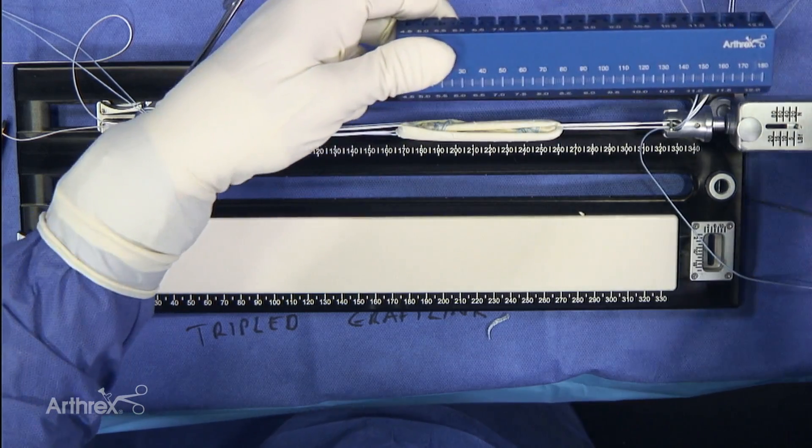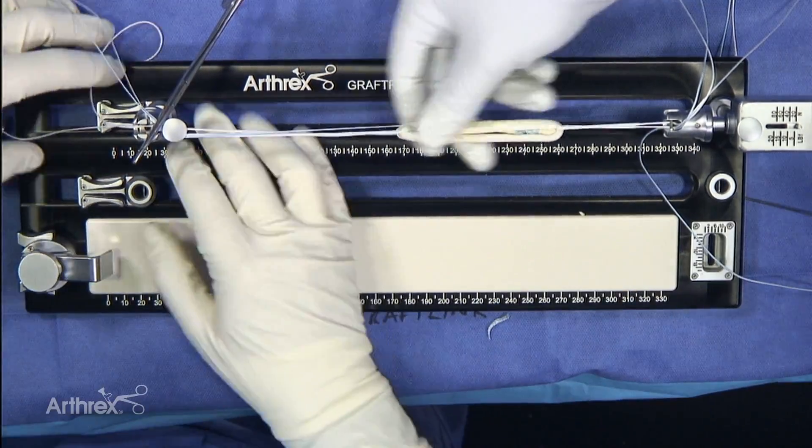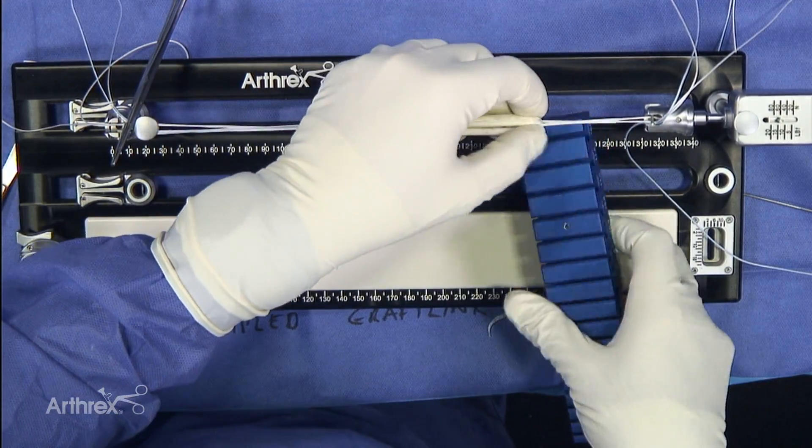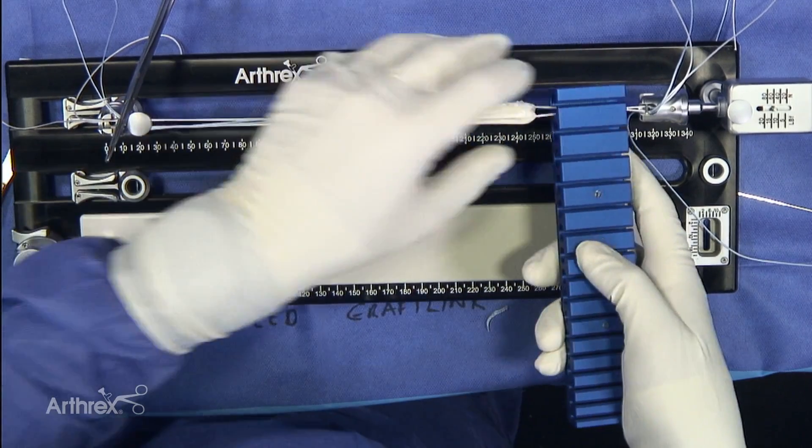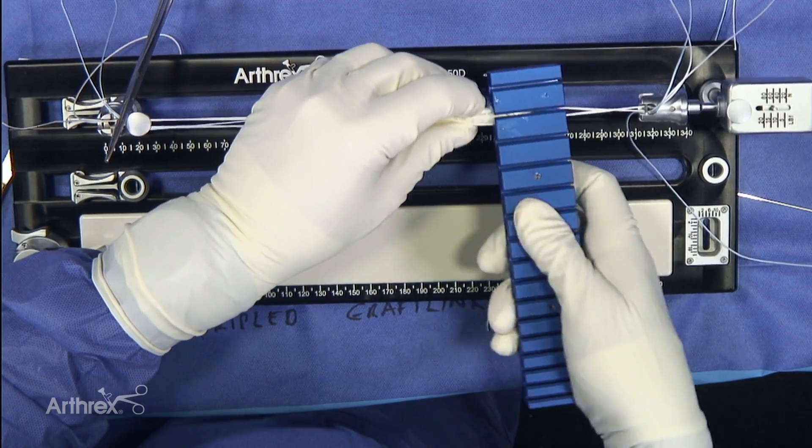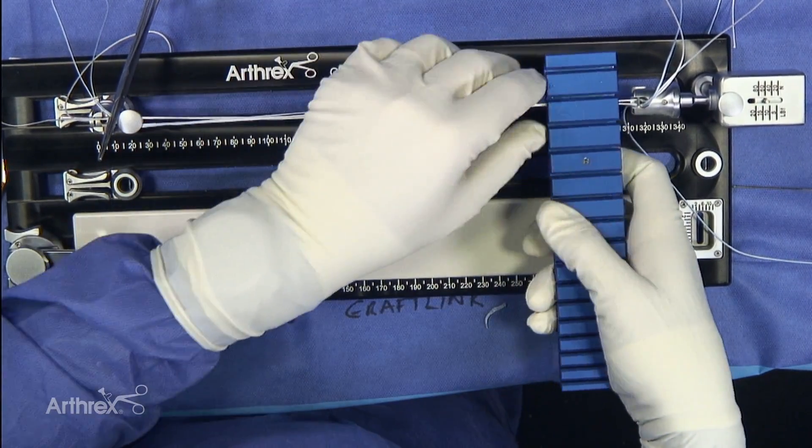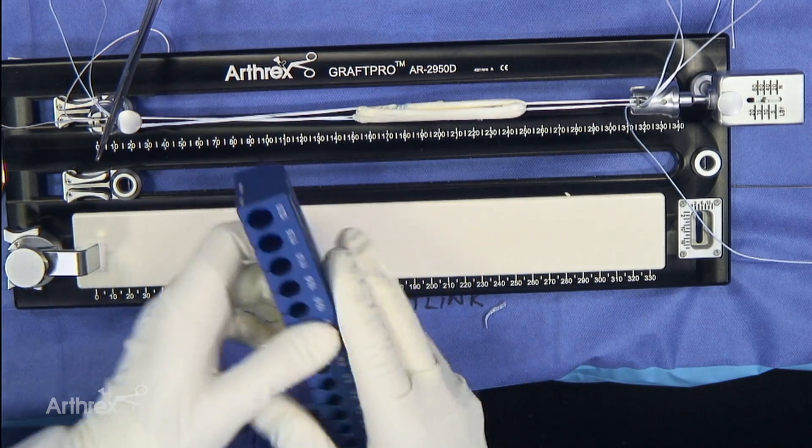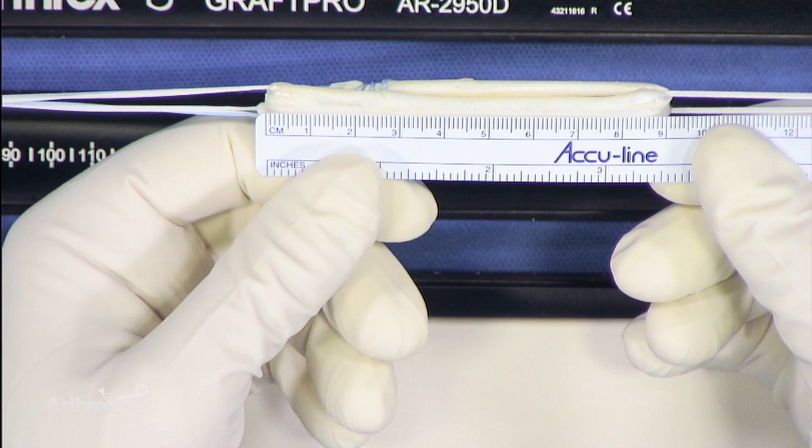And now we're going to wrap our sutures around a couple of times. Now one thing you can do is you can provisionally size this. So I'm going to get a little tension and we can get a provisional sizing here. So that's a nice tight 12 which is just ideal for the PCL. There's 11 and a half which is tight. Now it may shrink down to 11 and a half. I think 11 and a half. And I bet you 11 is going to be too tight. So we ended up with an 11 and a half. We'll have to do our final sizing once we get all our sutures in. And then here you can see the actual total length of the graft is a little over 90 which is ideal.